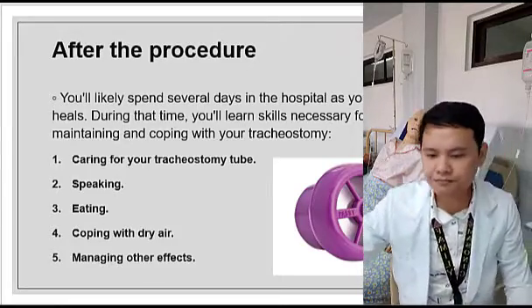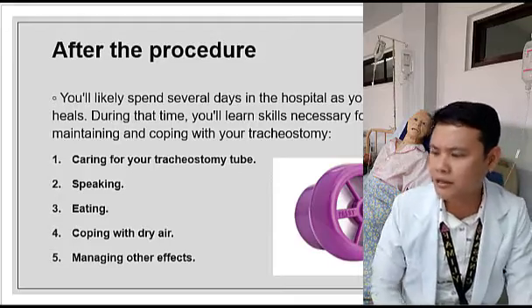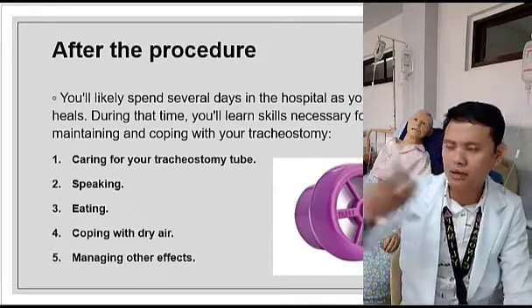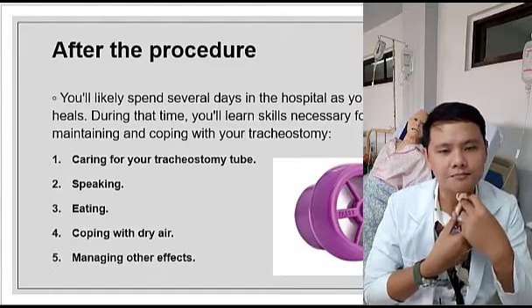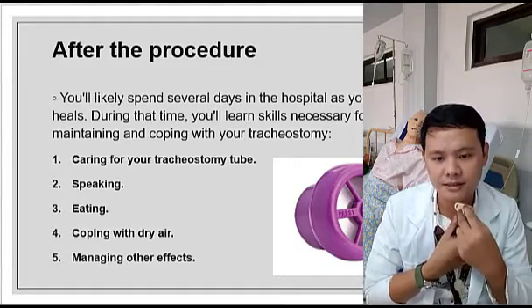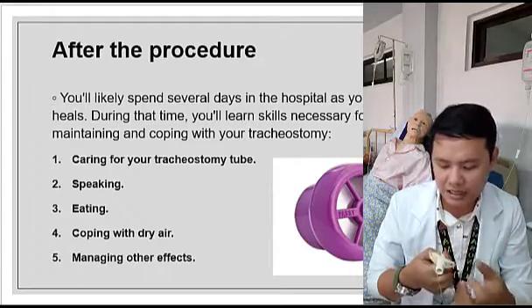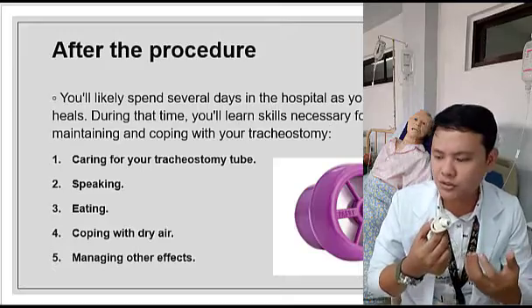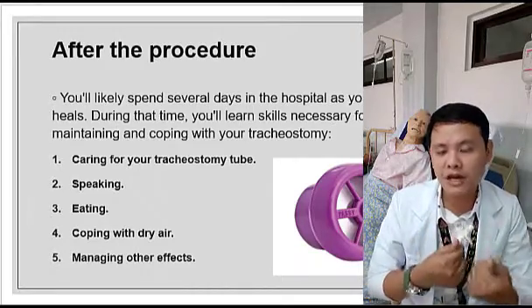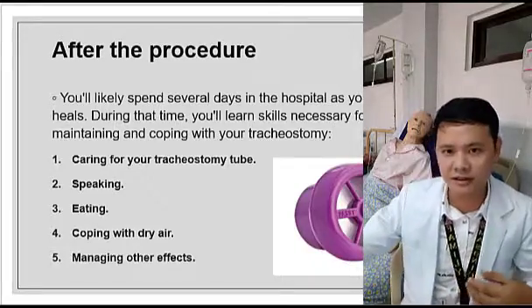Okay, what else? Managing other effects. Okay, kung bago lang na nakalagay, if the tracheostomy is newly inserted in the trachea, there's a possibility na magkaroon po yan ng build up ng secretions. So, how to manage those secretions? Well, magkakaroon ng suctioning. Okay, meron ba tayong suction machine? We have a suction machine here.